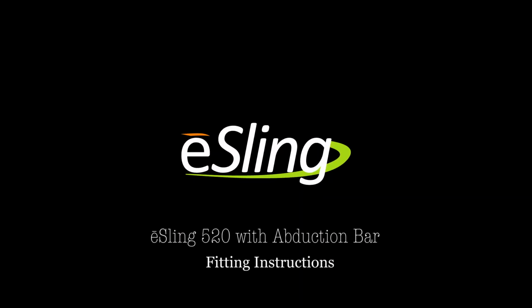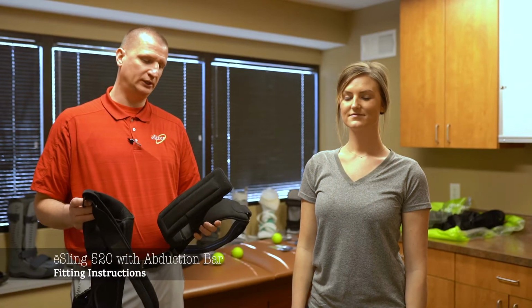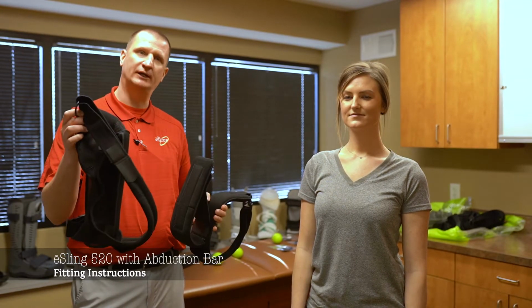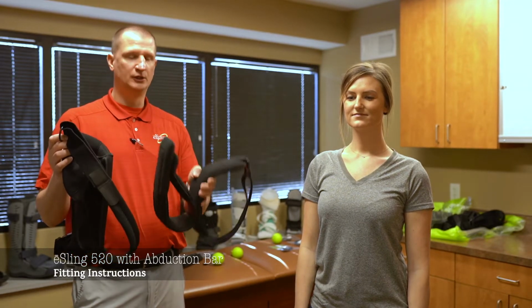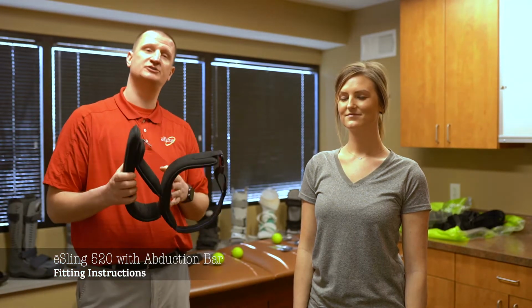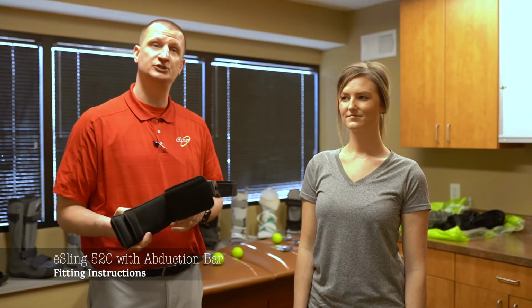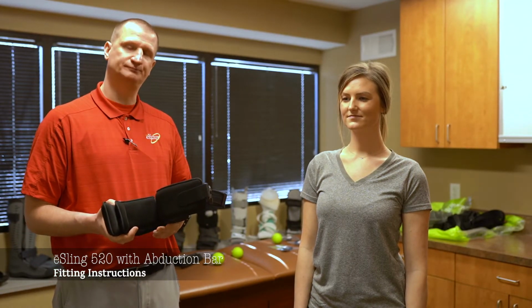Now we're going to do the fitting of the eSling 520. The feature of the 520 is basically having the torso mount section, but you're also going to have the cradle. So whenever you take this out of the bag, there'll be two separate parts. You're going to work with the torso mount first, so you'll get this fit onto the patient first. The nice feature of any torso mount sling is that you can do multiple positioning. We'll show you with the torso mount onto the patient.